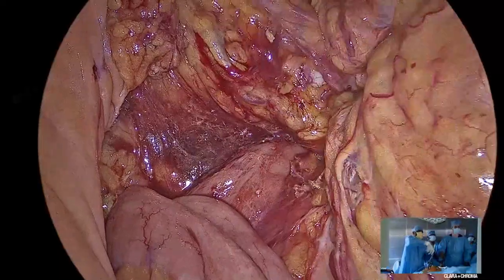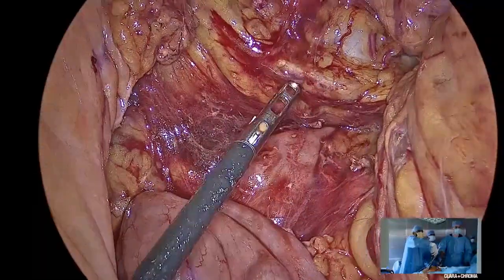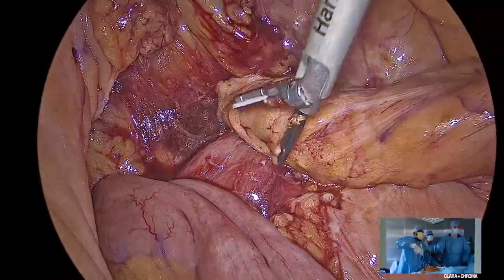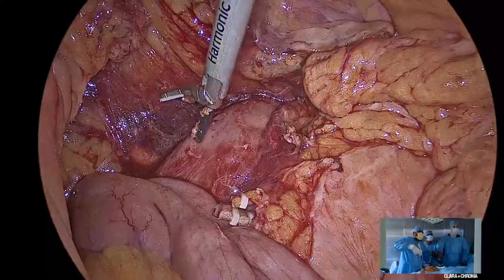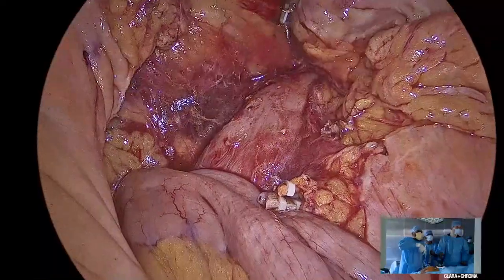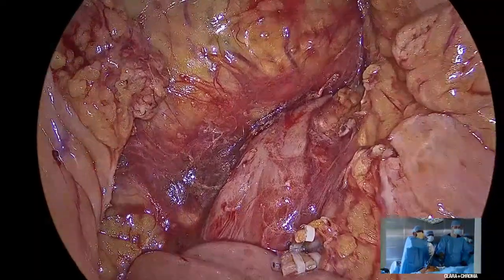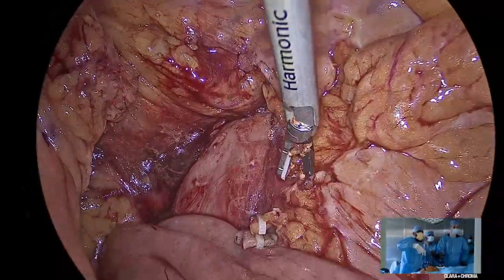So Anil, that's the second part of the duodenum, which we have patted down nicely, and we have gone as much as possible with the hepatic, with the right colon. Normally you get to this from superiorly, but today we wanted to do it like this because superiorly, with all those adhesions from previous surgery, things can be a bit challenging. So we have done whatever we can to the highest extent possible inferiorly. Are you happy with that? Yeah, wonderful. You can see the head of the pancreas now visible there, with the fascia preserved.